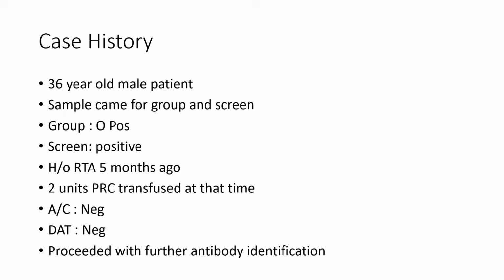Many times we need to take help of other advanced investigations like the use of enzyme panels and performing adsorption and elution techniques. But these techniques we will be discussing in the subsequent videos later on. So now let's hear from Dr. Prachi about the present case where we identify two alloantibodies.